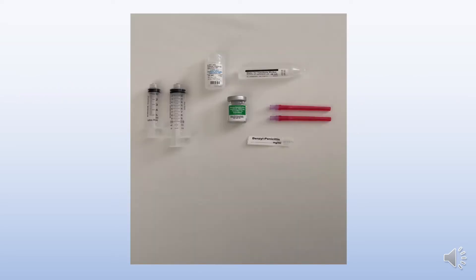Equipment you will need: 5 and 10 ml Luer-lock syringes, 10 ml of sodium chloride, 5 ml of water for injection, 2 filter needles, benzyl penicillin 600mg, and a label.